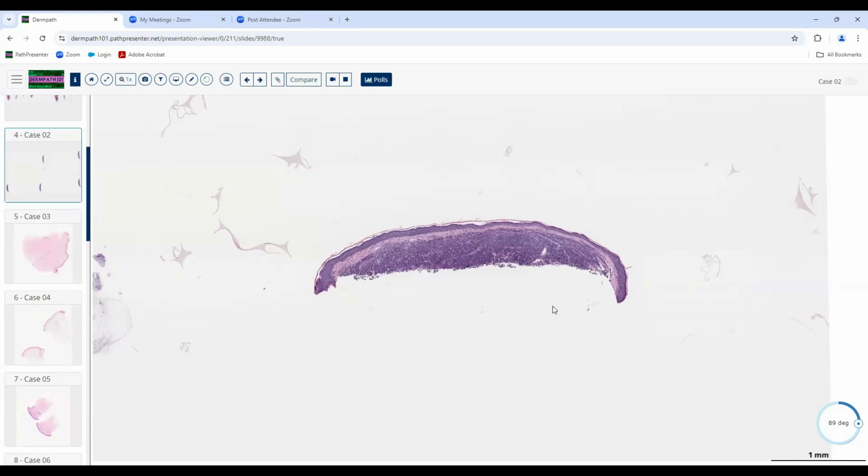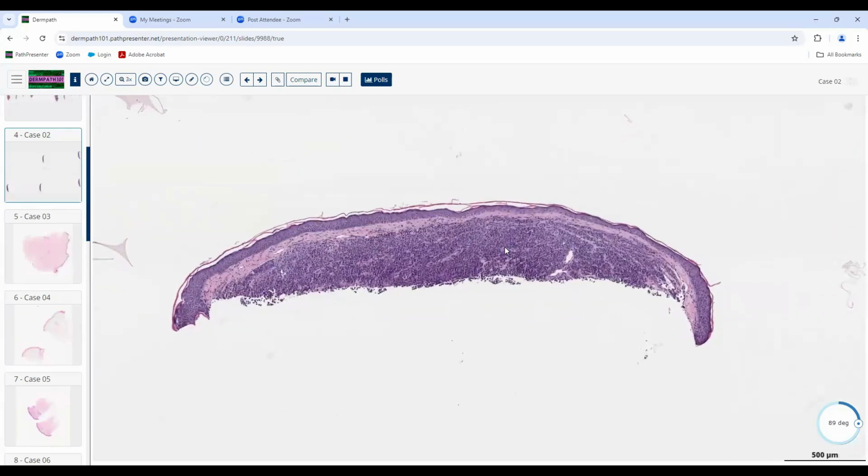It seems to be relatively small. It seems to be fairly well circumscribed. We can draw a line here, a line here. It's hard to talk much about symmetry. Maybe it's a little bit asymmetrical, but not dramatically so. So we're not really too concerned about it when we first look at it.